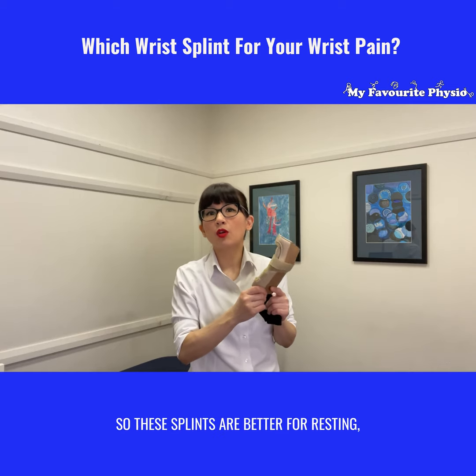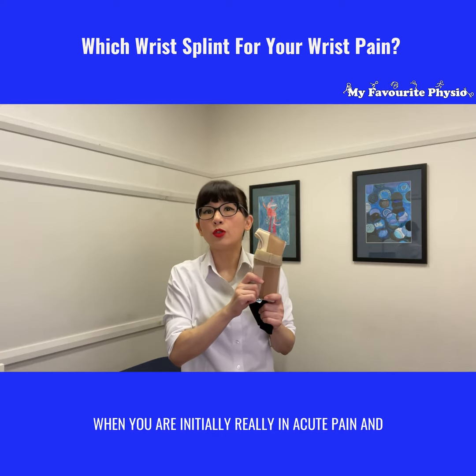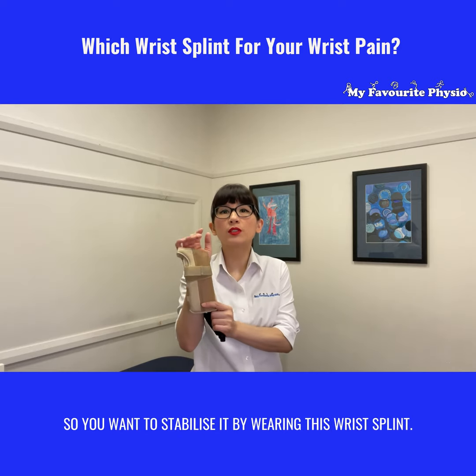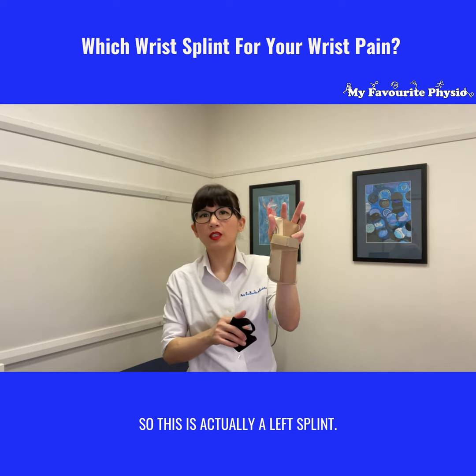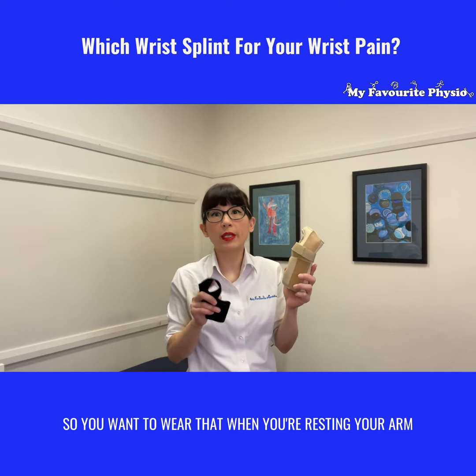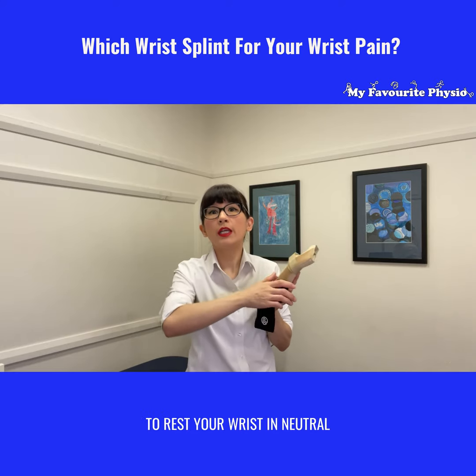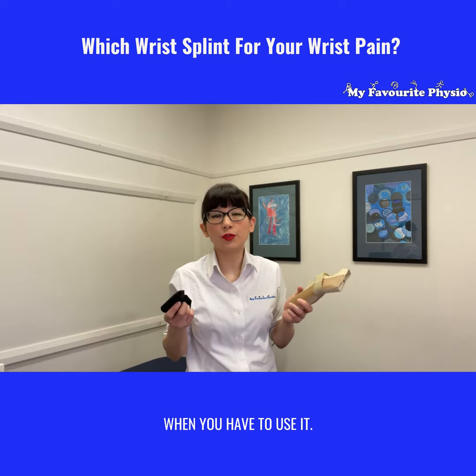So these splints are better for resting. You might want to use them when you are in really acute pain and you just find that any movement and jarring hurts it. So you want to stabilize it by wearing this wrist splint. This is actually a left splint. So you want to wear that when you're resting your arm and not doing activities. A great time to use it is often as a night splint, to rest your wrist in neutral so that your wrist is ready for the next day when you have to use it.